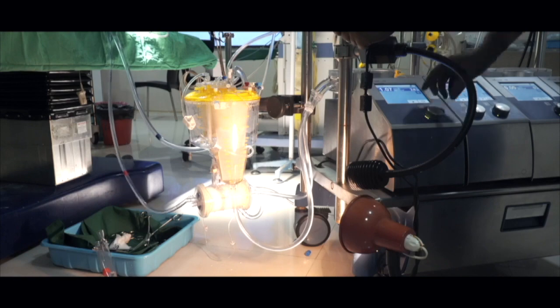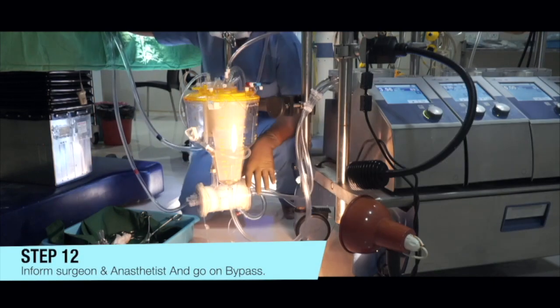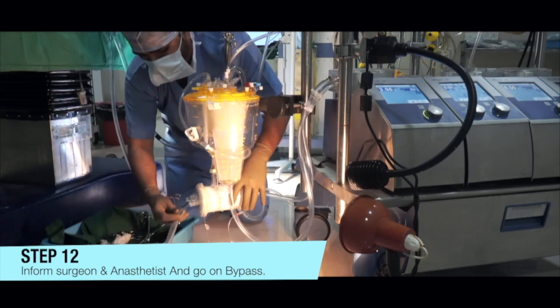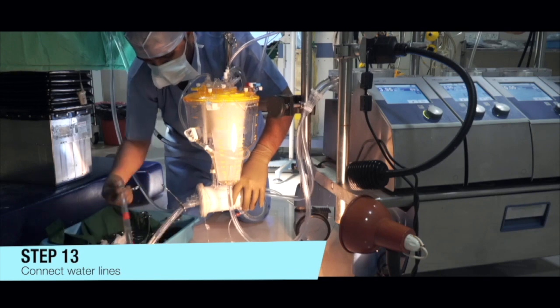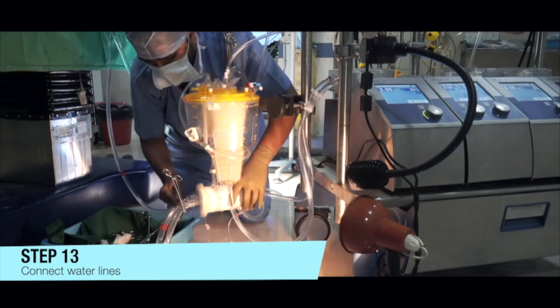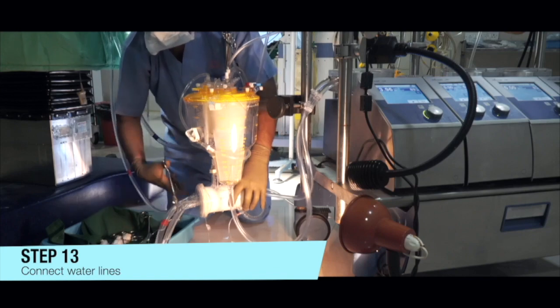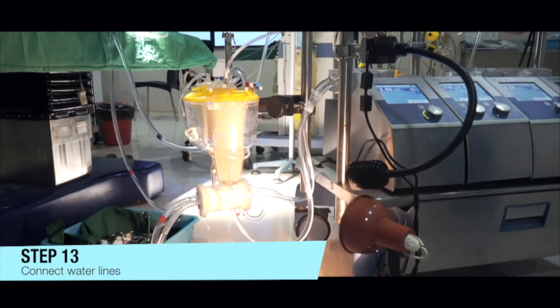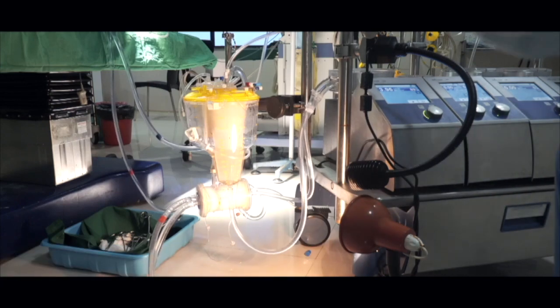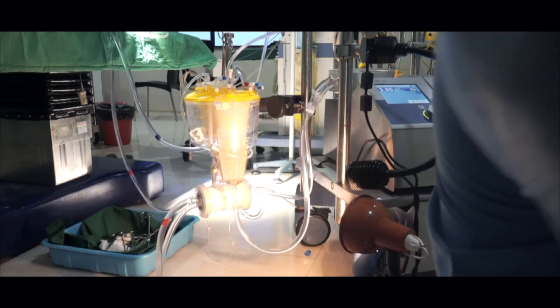And before doing this, inform the surgeon and anesthesiologist. Now the last step is to connect the water lines so that we can rewarm the patient. And the most important thing is that after doing this procedure, please repeat the antibiotic to avoid infection from this procedure. I hope this information will help you in your perfusion career.